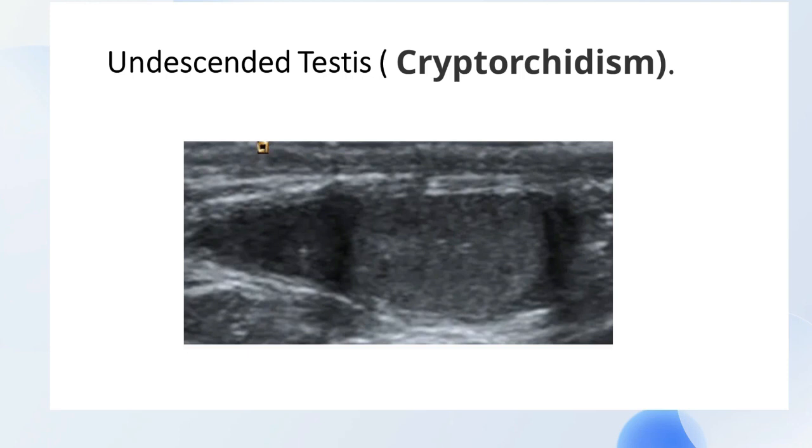You can find varicoceles in the pampiniform plexus due to blockage of the veins or incompetence of the valves. If they persist like that, they can be one of the causes of infertility. So make sure that you capture those things as well when you're doing a sonar.